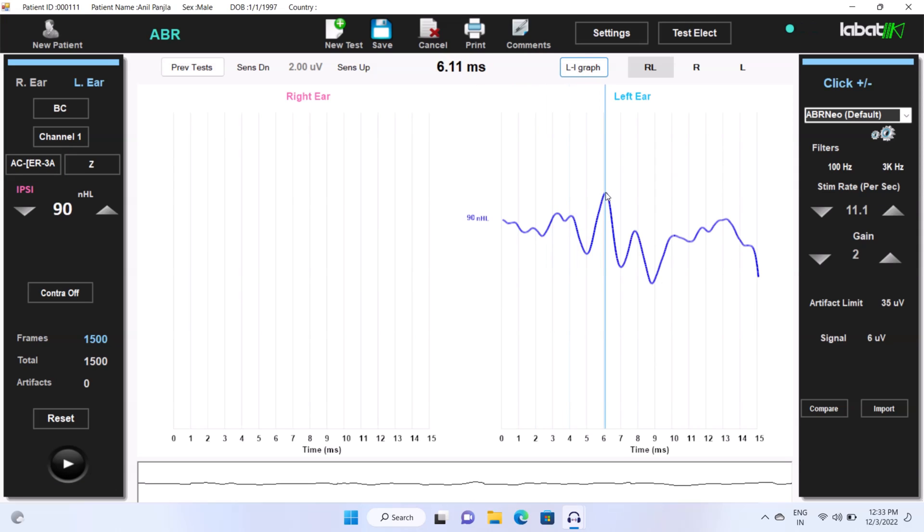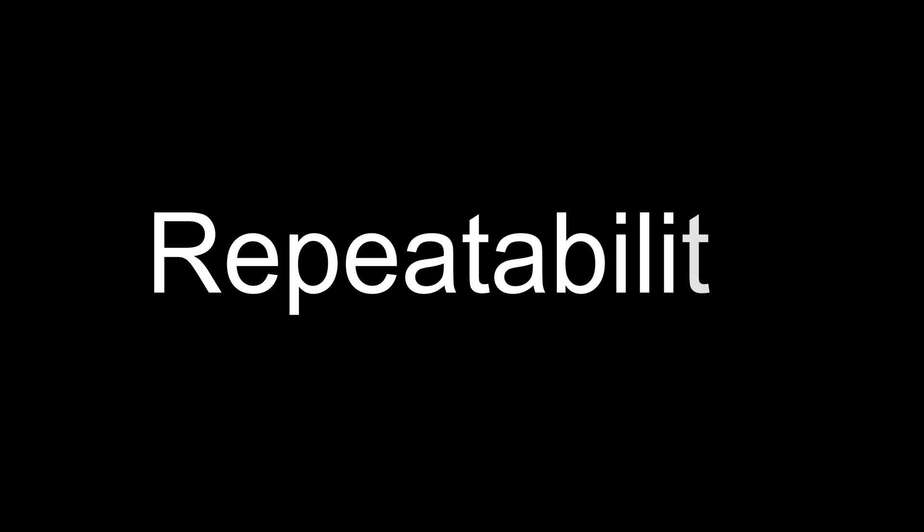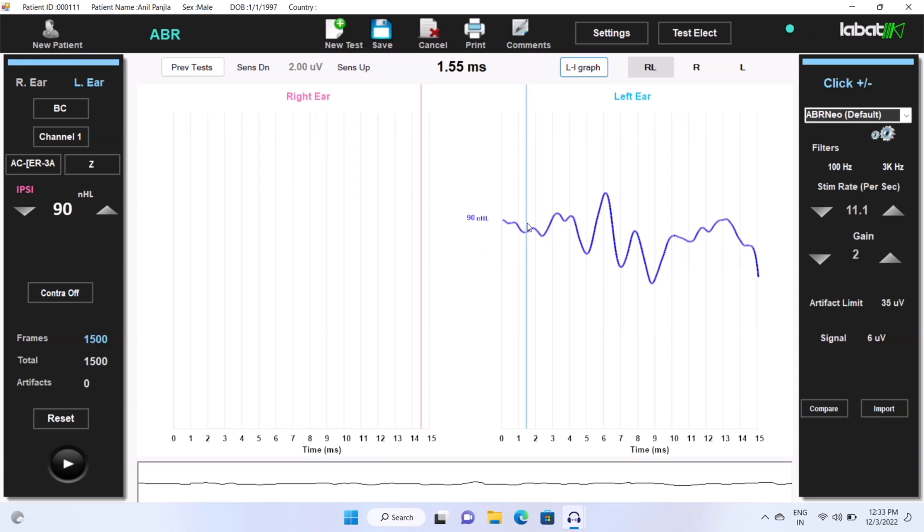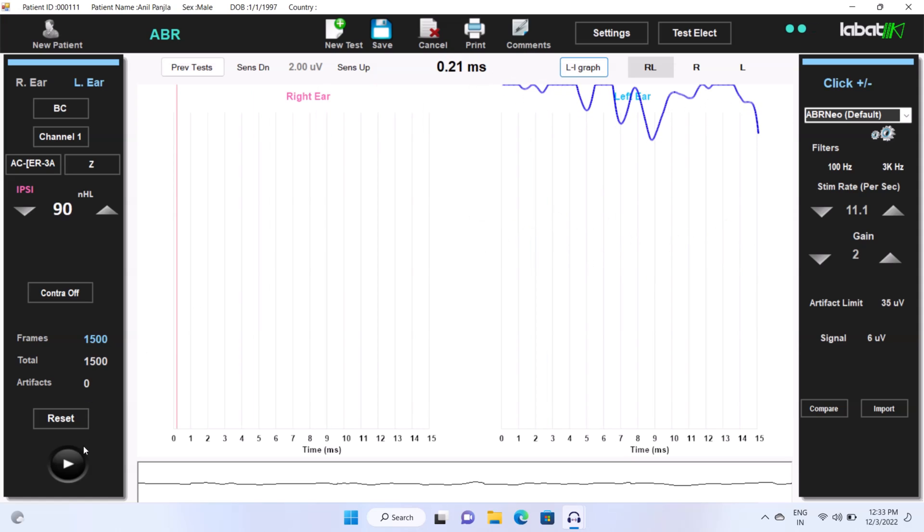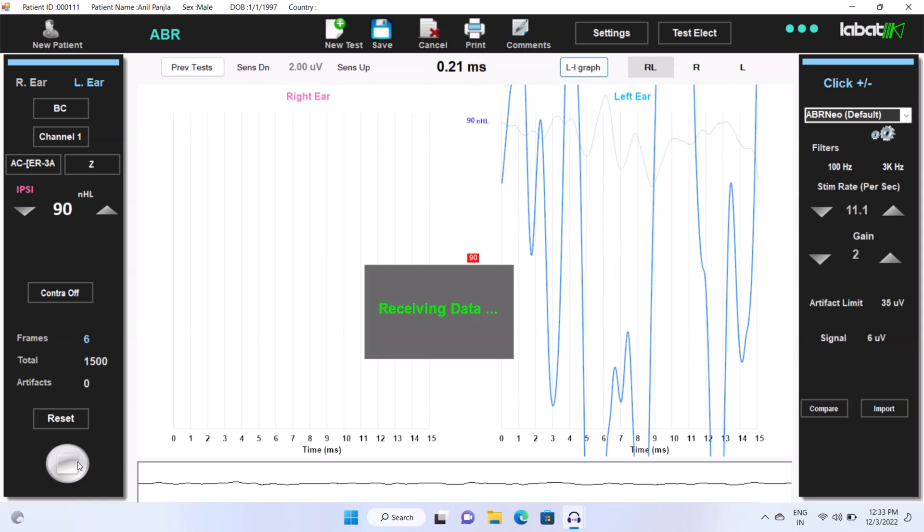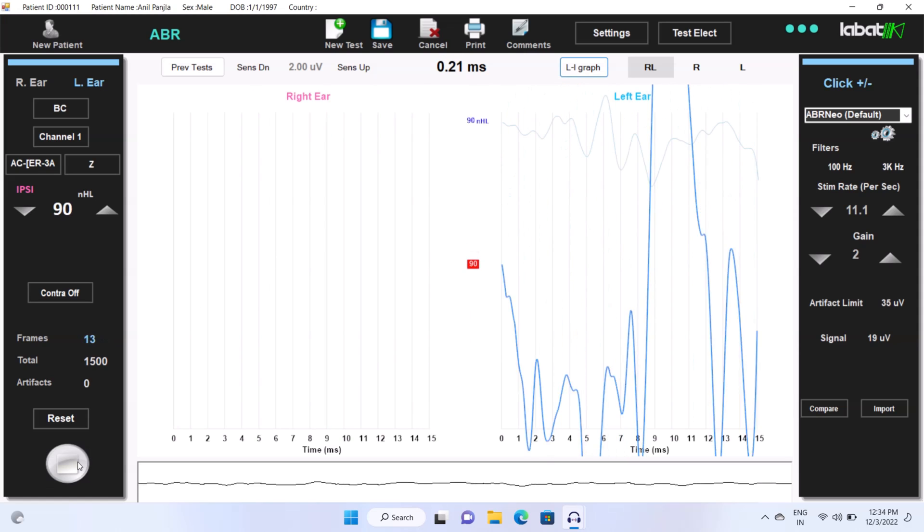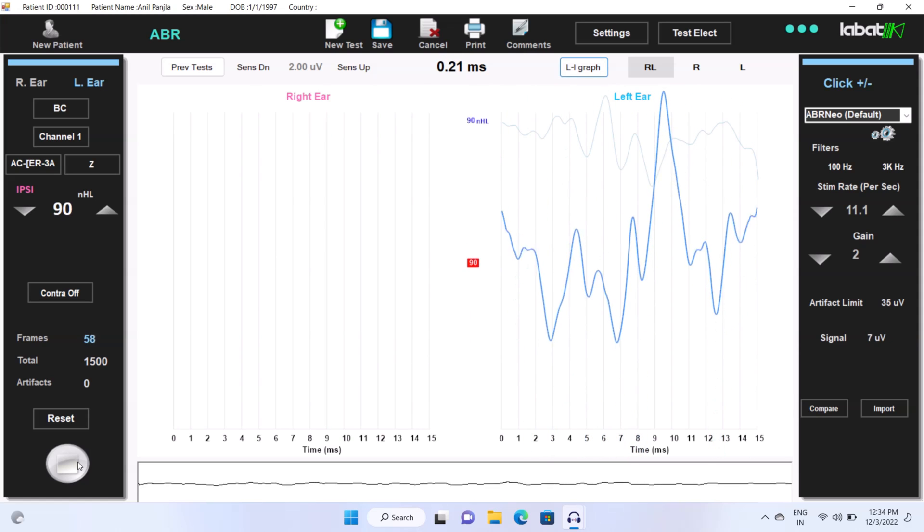Now we get the results. Now again, we do the test on same intensity for repeatability.